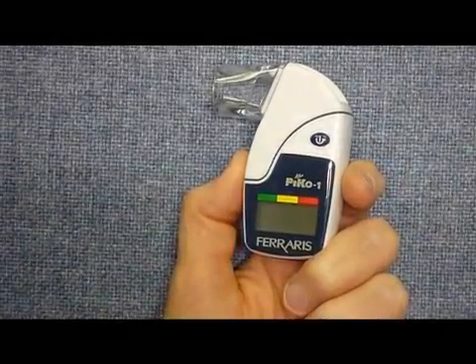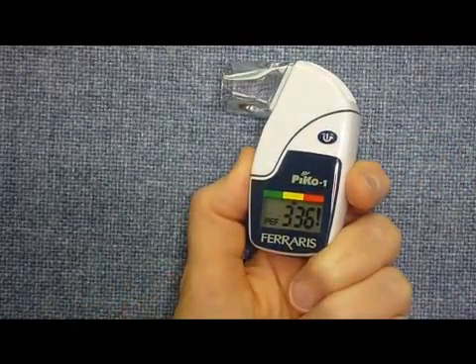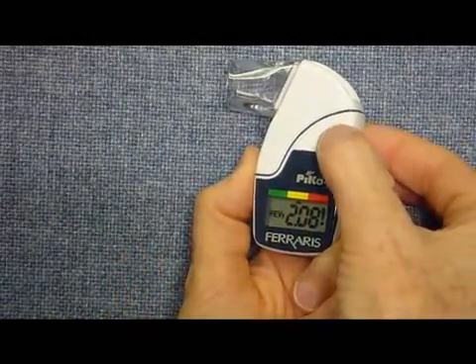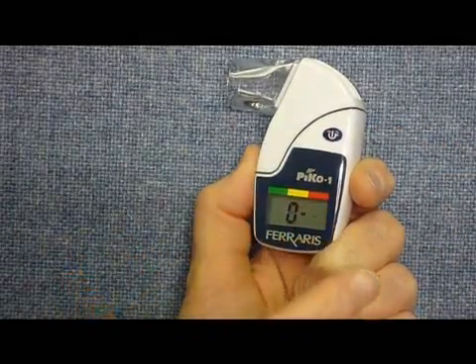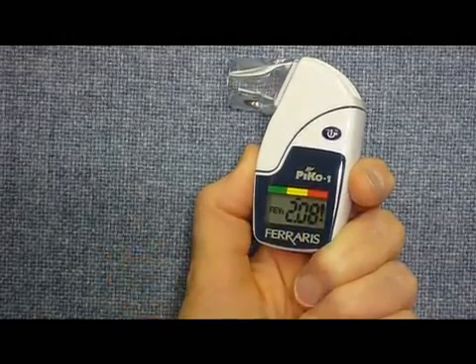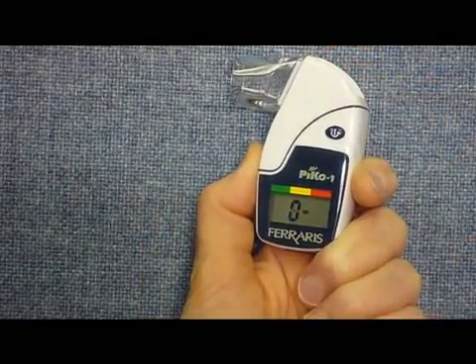This is a demonstration of how to turn the PICO-1 peak flow meter on. You push the button right there and you'll see that it comes up with numbers from the test before. To do a new test, you want to be sure that this is reading zero. So I'm going to hit that button twice, and you'll see that it goes to zeros. Now it's ready for the test, but you need to quickly do the test because it will go back from being zeroed again. I'll push that again and get ready to do my test, keeping my hands underneath so I'm not blocking the flow out of it.